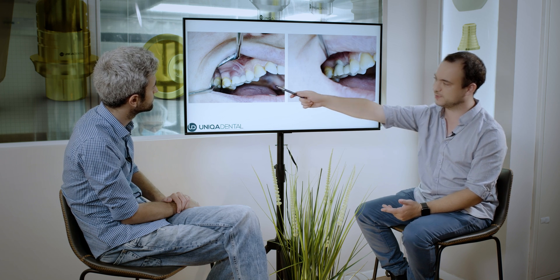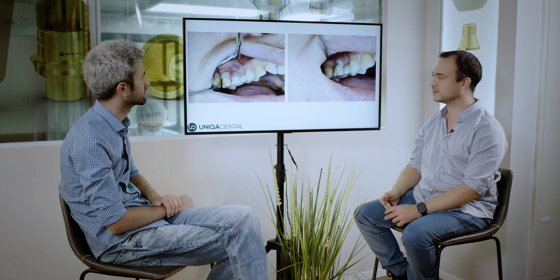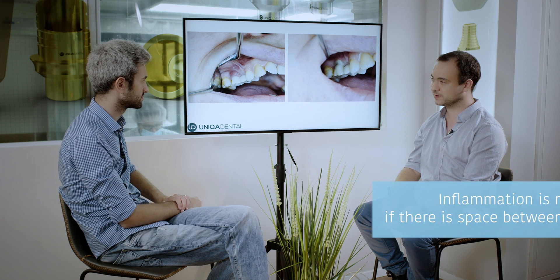This is the before and after. Here you can see the before — the inflamed gingiva — and here you can see the after. Because the healing caps were a little bit smaller in diameter, when we put back the bridge you can see a little bit of pressure on the gingiva, but this pressure will go away in about one to two hours, so it doesn't really matter. The bigger the space between the crowns and the gingiva, the better the patient's ability to clean below the bridge, and the less chance this will occur again.